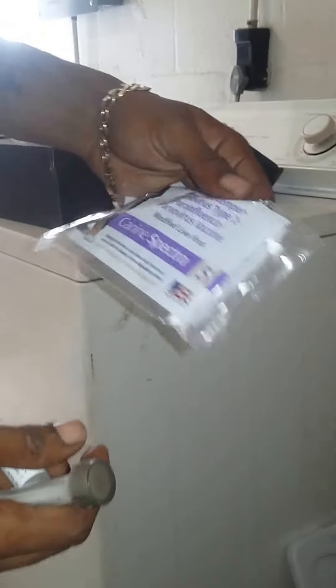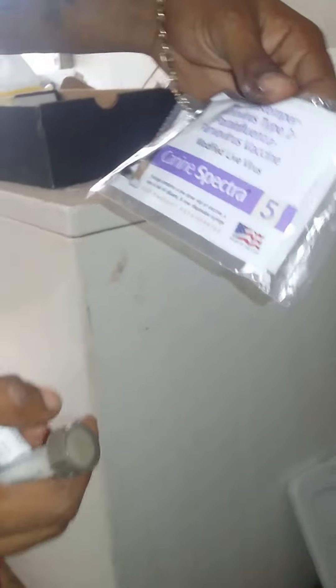I'm going to show you how to vaccinate your dog. You got a clear liquid and you got a powder form. First thing you need to do is separate your liquid.